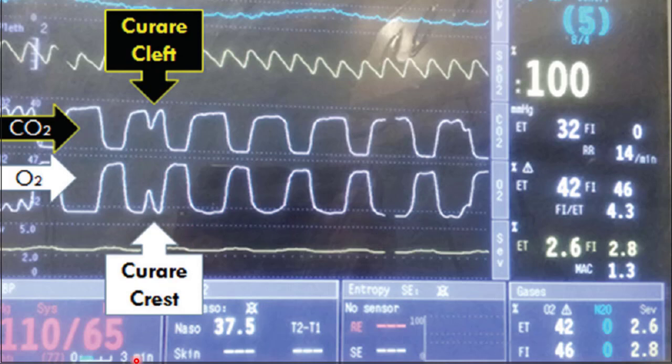Now, reality, unfortunately, is in most pre-hospital services today, maybe not in 5 years or 10 years, we do not have access to this information at all. We just have access to this. So you have access to your End-Tidal CO2, you have access to your pleth, an EKG somewhere.